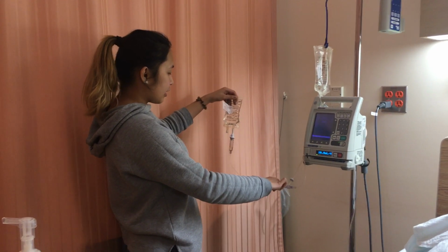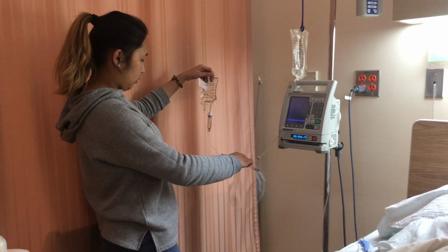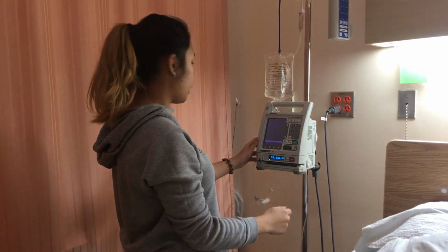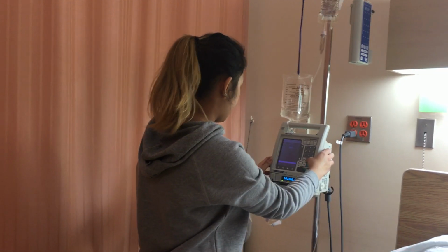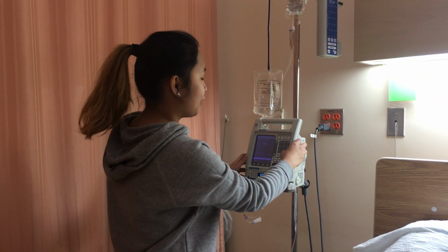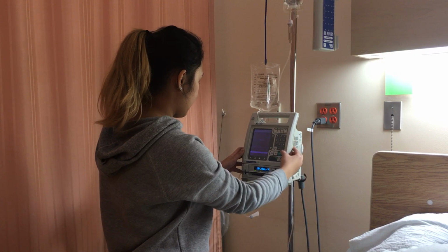Now I'm back priming to let the fluid flow and get rid of the air bubbles from the tubing. I'm going to fill the chamber one third to a half full. At this, I'm going to put in my infusion rate now, and it calculated it to be the rate for the secondary line is 107 milliliters per hour, and the volume to be infused is 107 milliliters.